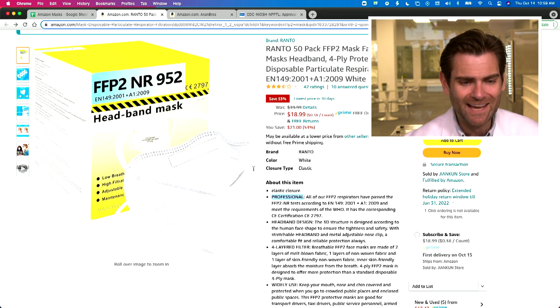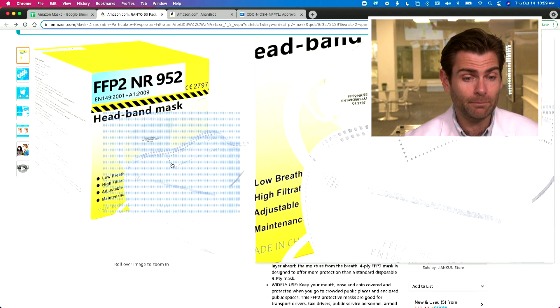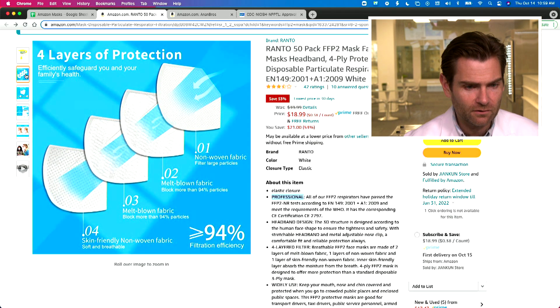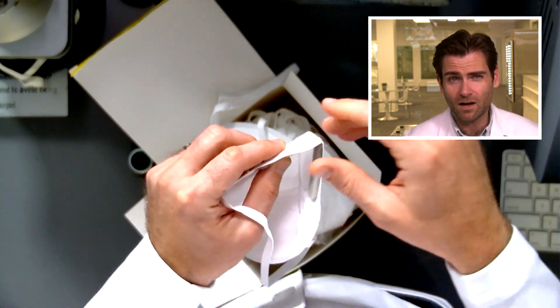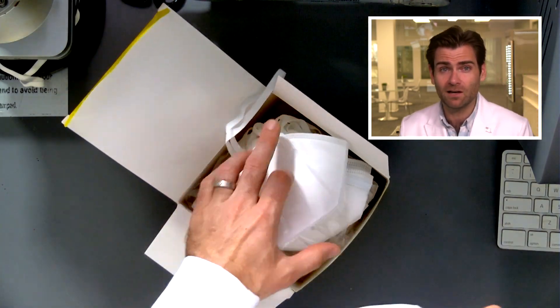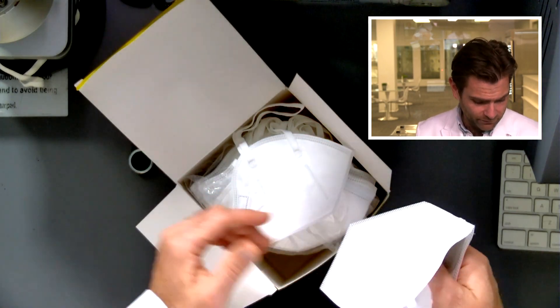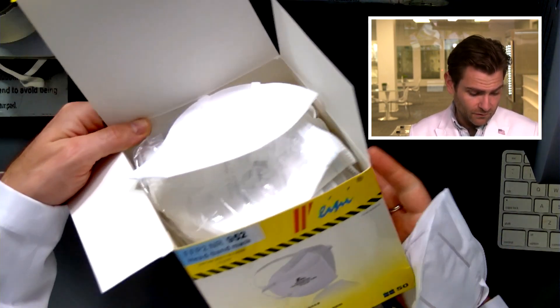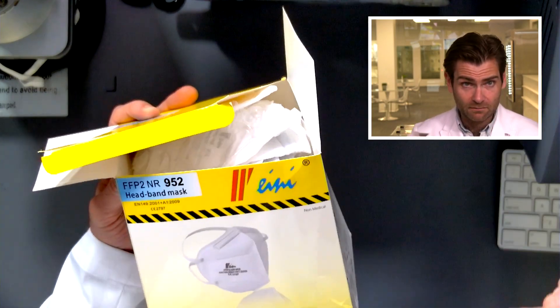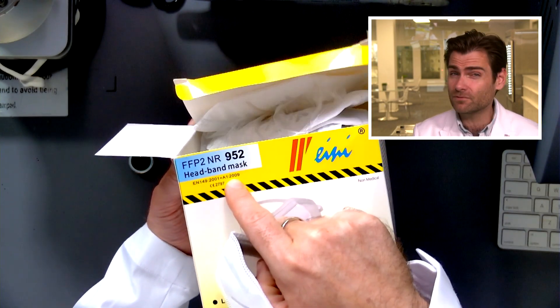This is basically the KN95 design with a head strap — you've seen these before with N95s, but it has the headband instead of ear loops. FFP2 is a European standard. The airflow resistance breathability is 166, which is pretty high for this KN95 style. We usually like to see below 150 for that. I'm guessing FFP2 uses the N95 style, so I'm thinking it should be hitting 95% filtration.